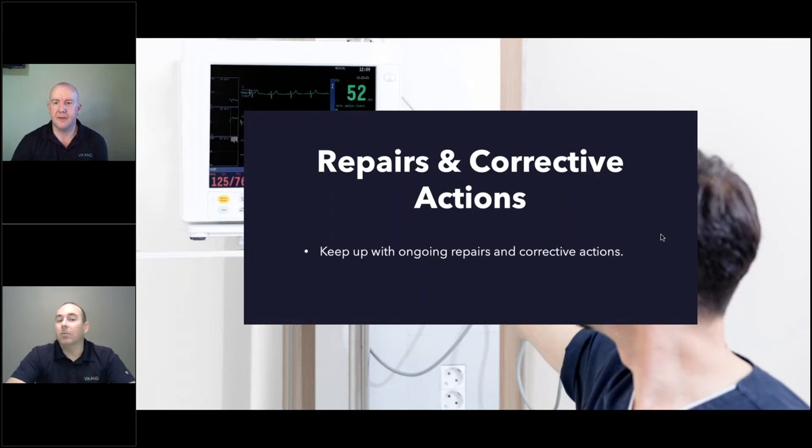It can be found during a PM visit where we say, oh, this device isn't working correctly. Most of the time we have the small parts on hand. We can fix it right away, get the machine back up and working correctly. If it's more deep than that, then we will utilize chain of command and follow process to either evac that equipment off the ship to where it can be repaired, or maybe we just order a part and send it and liaison with onboard IT or onboard engineers. And we'll get the electrical or mechanical engineers involved and we'll walk them through the repair process as well.